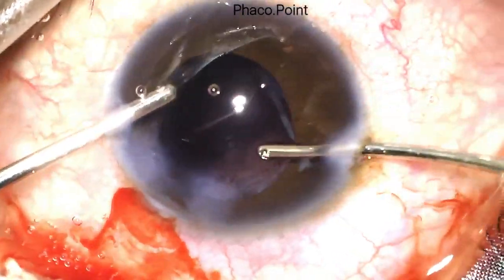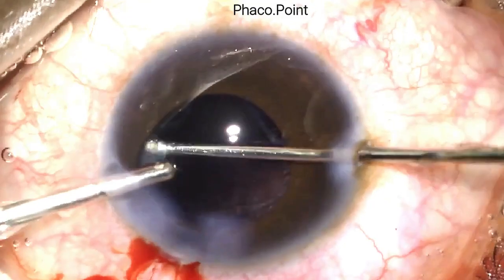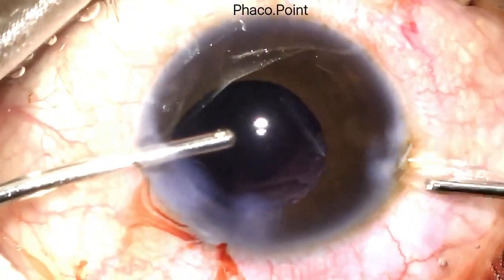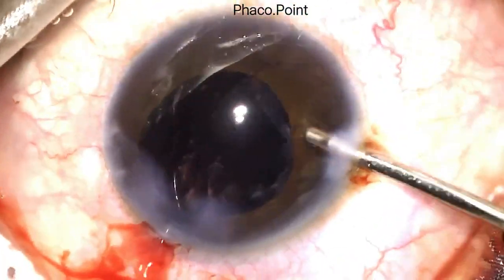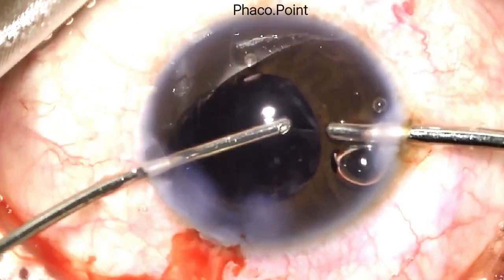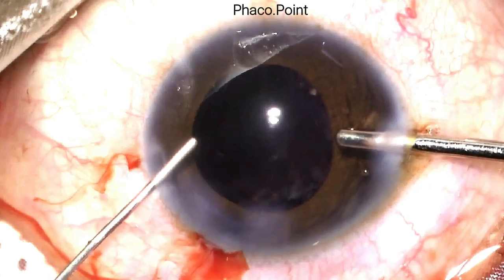I then proceed to a very careful bimanual irrigation-aspiration to remove the cortex. I perform a viscofluid exchange prior to swapping hands to complete the bimanual irrigation-aspiration. At the end of irrigation-aspiration, once more I perform a viscofluid exchange. Performing a viscofluid exchange is perhaps the most important step in a case with a compromised anterior capsule.